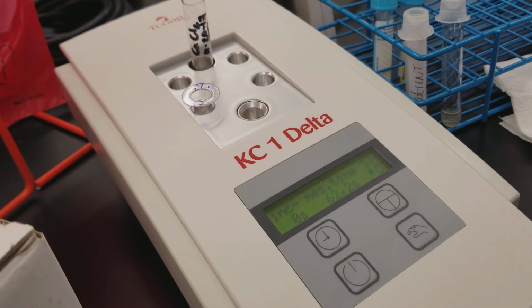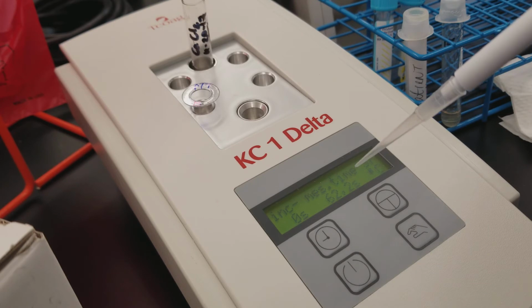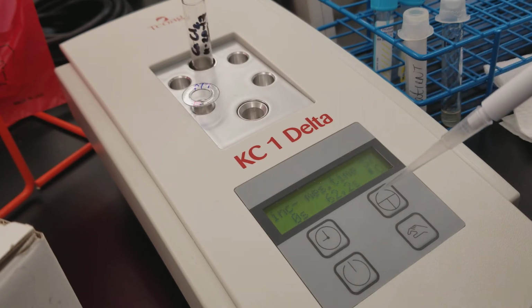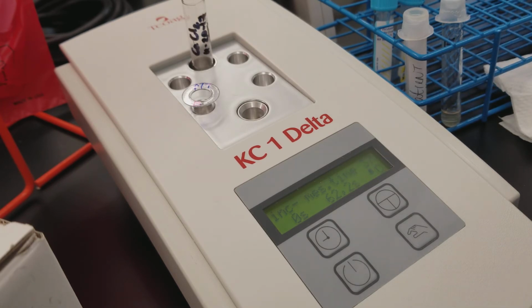So this is not critical, but this is high. So either the specimen was starting to clot when you put it on the analyzer, or this patient is on therapy that is causing them to not clot. Since it's PTT, it might be heparin. A more accurate heparin analysis would be anti-Xa, but we don't have that here.